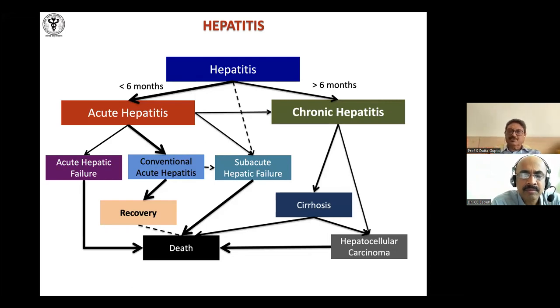Then the other ones, for iron, you are absolutely right, depend on the clinical picture. Or after doing this, all of a sudden we find a lot of hemosiderin pigment, then we would like to do an iron stain for whatever cause there is, and so on.